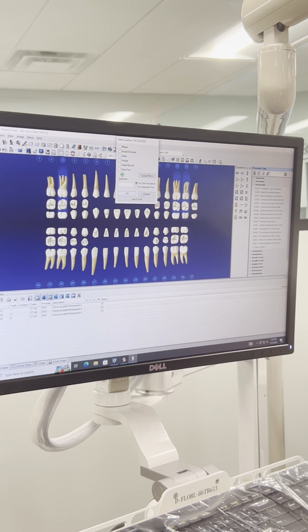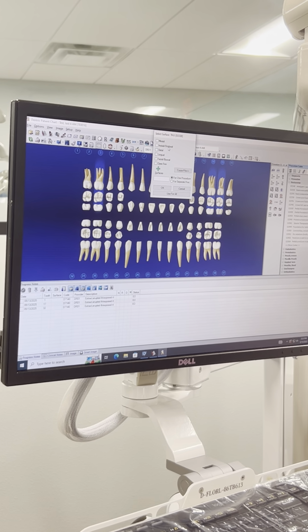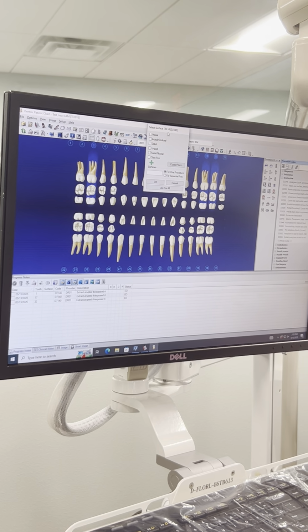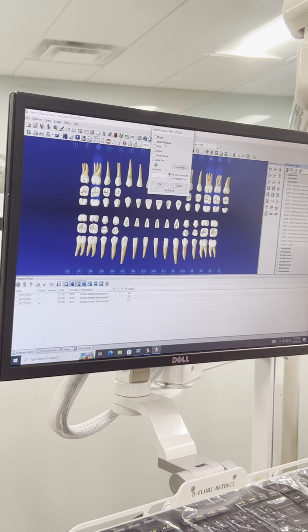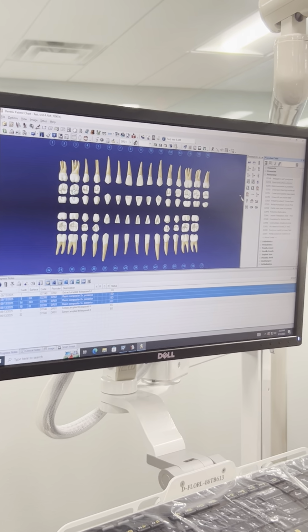And because I selected multiple, they're gonna show here the tooth number. So this is for 3. If it's occlusal lingual, it's just gonna go with OL. Now for 14, let's say it was DO. I wanna click on occlusal. And let's say for 15 it's just occlusal.